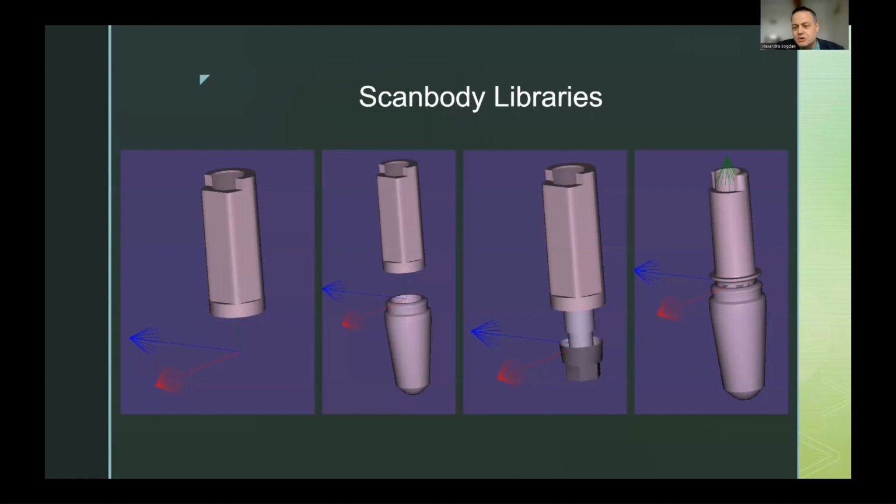So now the computer knows where to place this hybrid and build the crown upon this hybrid that we are going to cement inside to do a screw retained crown. This is also the way to do custom abutments or bars or anything else that you need doing from a digital scan.